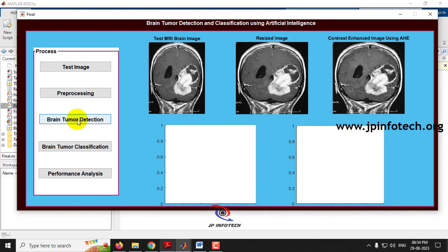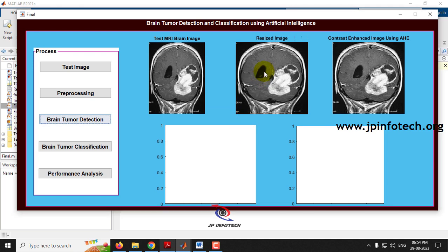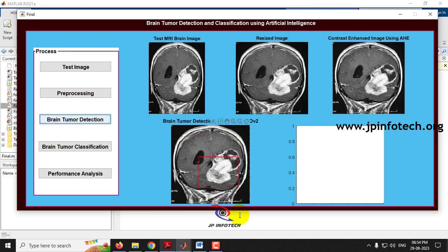Next comes brain tumor detection using YOLOv2. Click 'Brain Tumor Detection' and wait a few seconds for processing. The trained network model is loaded for brain tumor detection — click OK. You can now see the brain tumor detected region based on YOLOv2.